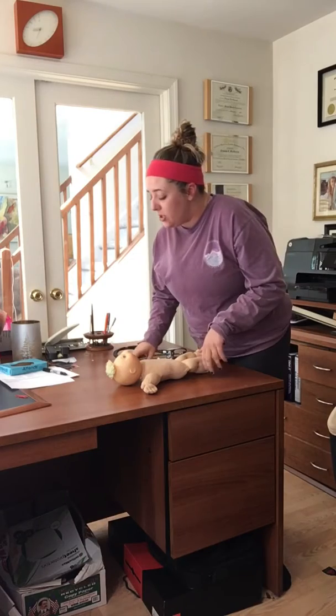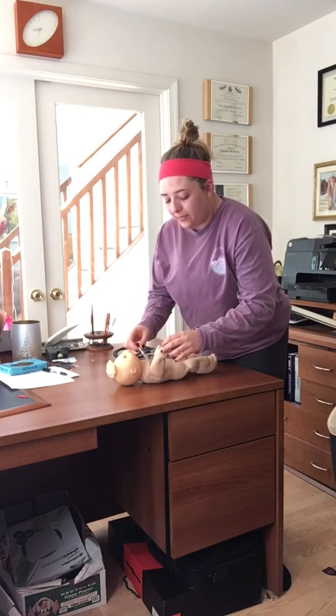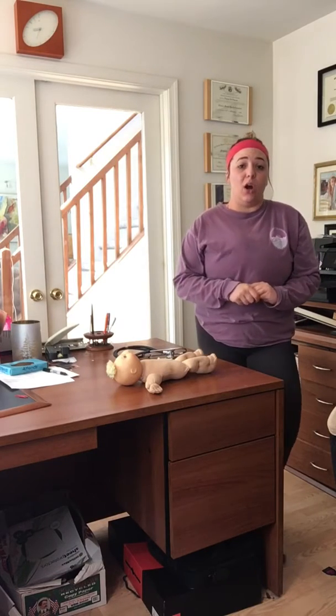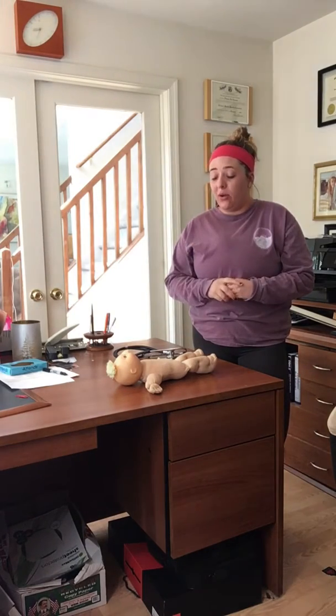I would take my patient's temperature, axillary temp underneath the armpit, just like so. Then I got 98.6 or 37 degrees Celsius. Normal temperature ranges are 97 to 100.4, so nothing to worry about there. My patient seems stable. Newborn seems to be within normal ranges.